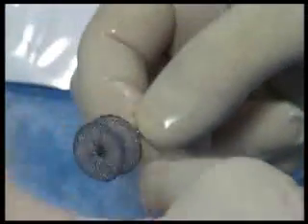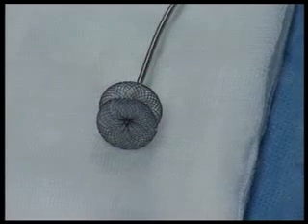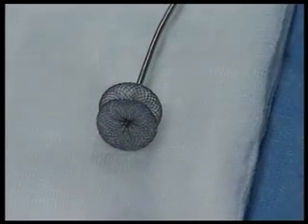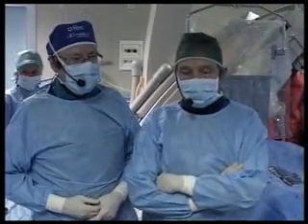Okay, Carlos. I have a question. Maybe Carmelo can answer that, and also Kevin and Mario. You guys have such a wonderful picture on 3D. Have you ever considered choosing your device based on the area of the defect?